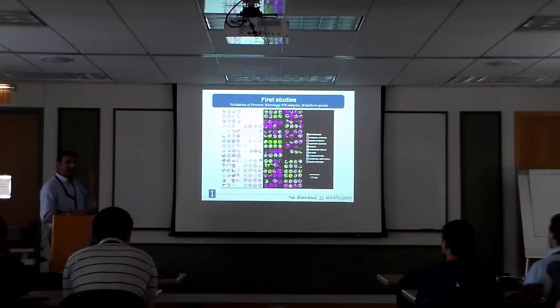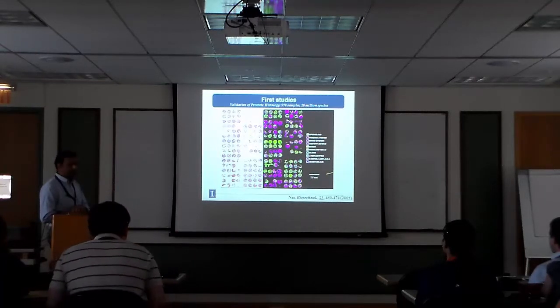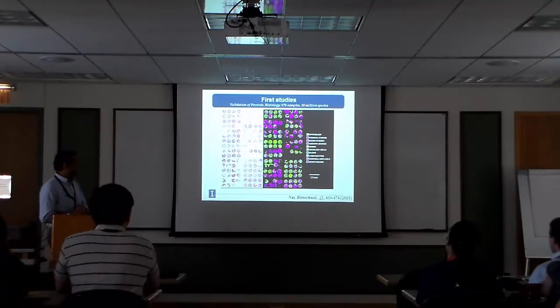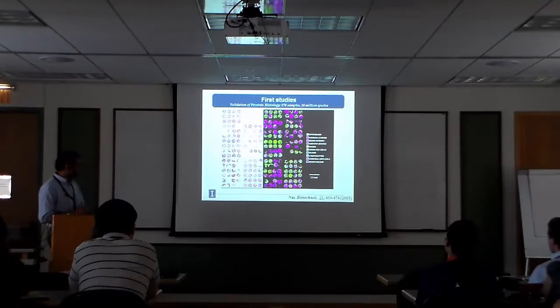If you put green epithelium in your mind, then on every slide, the green you can just check off as green epithelium. So the whole thing is consistent. You'll see a length scale, so you'll see how big the tissue is, and whatever test we're doing will be right over at the top. Okay, so that's how you'll look at this. Now this study is a historical study in the sense that it's really old, but it's also very interesting.